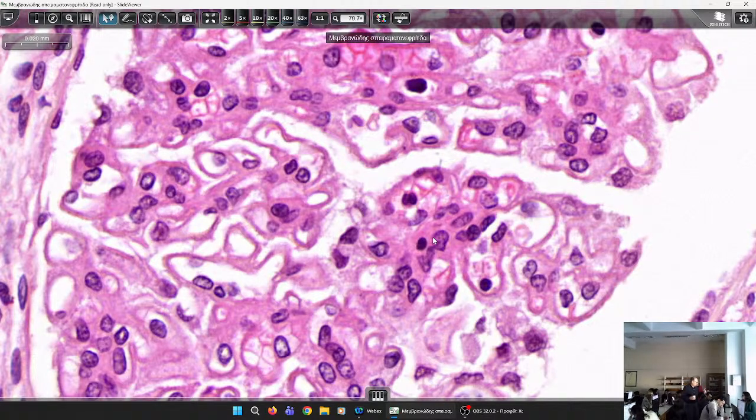So we have nephrotic syndrome, we have positive immunofluorescence. That means we have granular, diffuse, global immunofluorescence. So it is immune complex deposition related, and it is not some sort of podocytopathy, because there are 2 podocytopathies having nothing to do with immune complex deposition, which could justify a nephrotic syndrome.